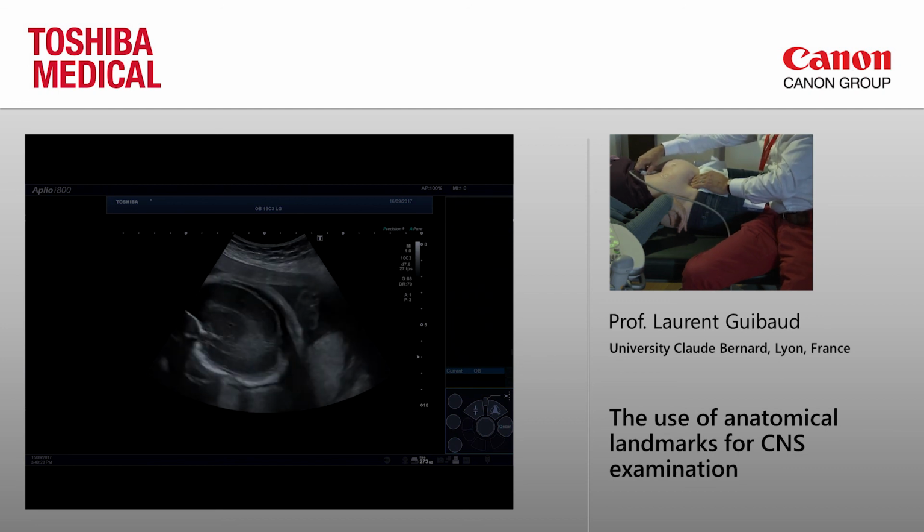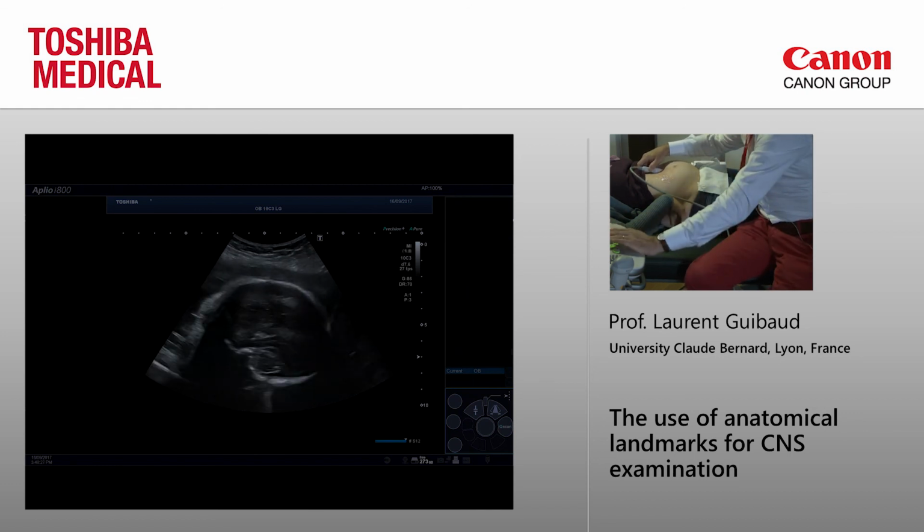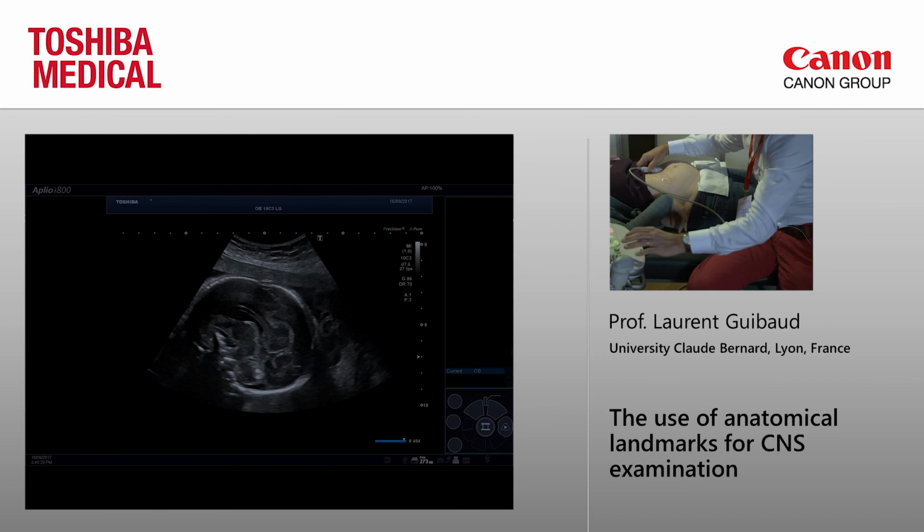Yes, it's better. You see here all parts of the corpus callosum. You see the rostrum, the genu, the body, and the splenium.